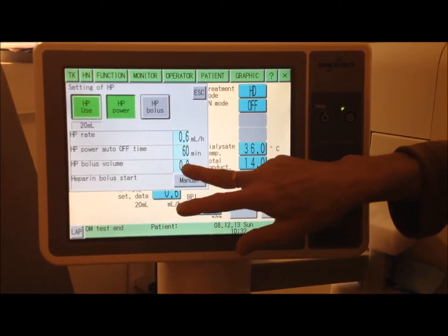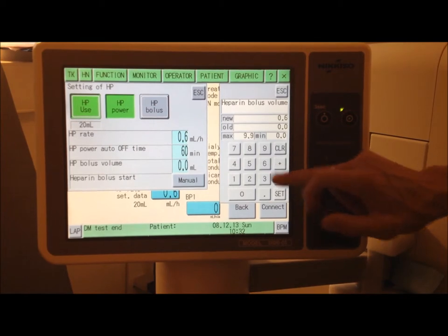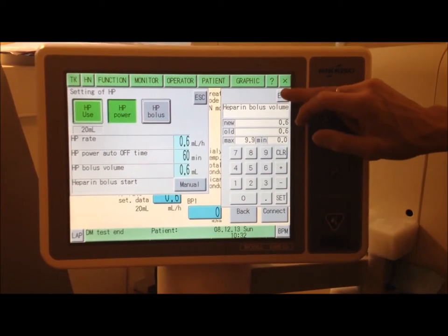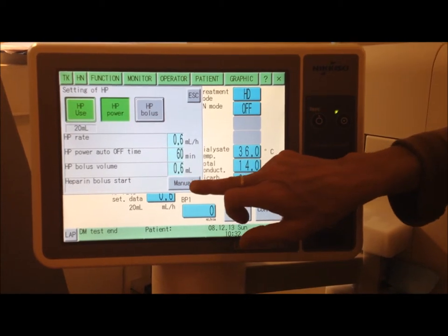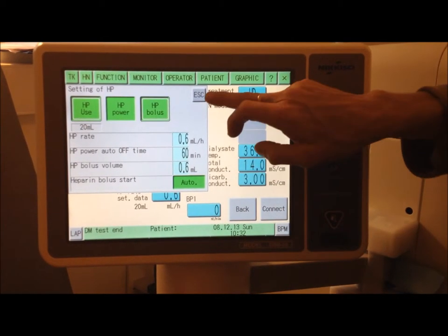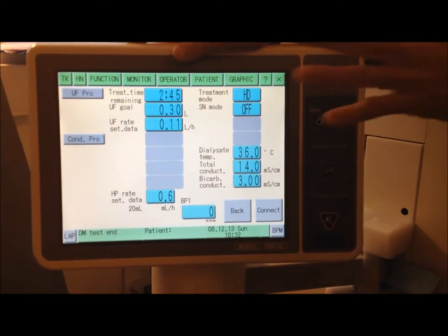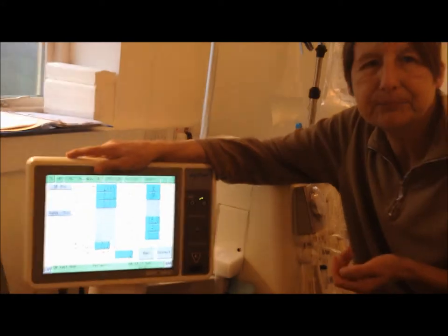Come out of that, and then your initial dose of heparin — 0.6 again. Set that, come out. And last but not least, change manual to auto. All the treatment data is now set up for the machine to be used.